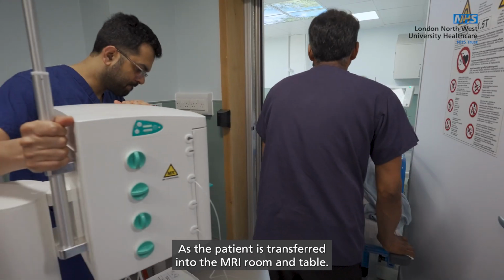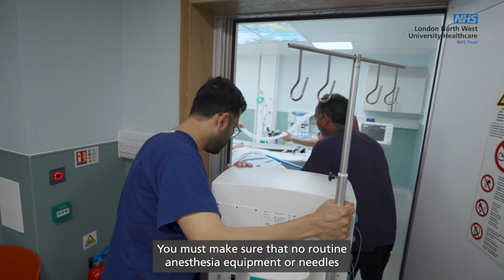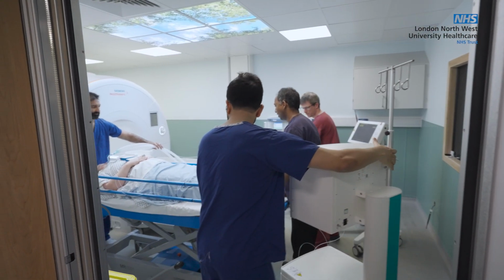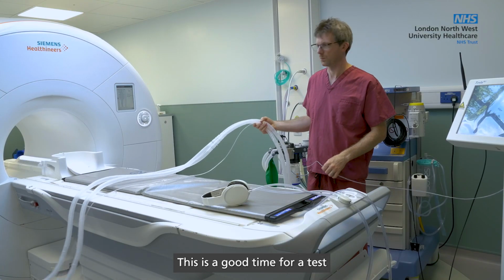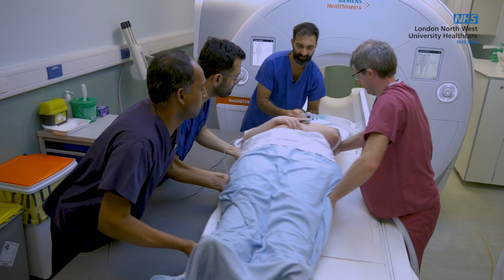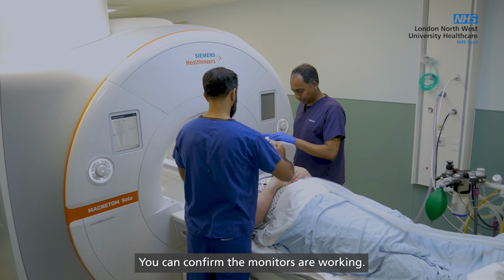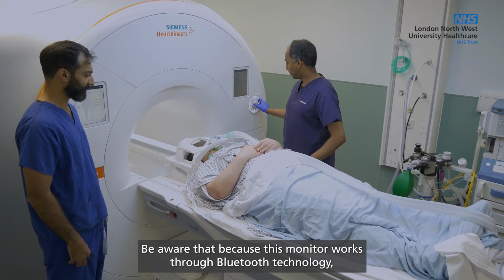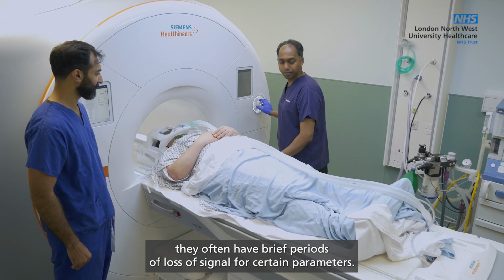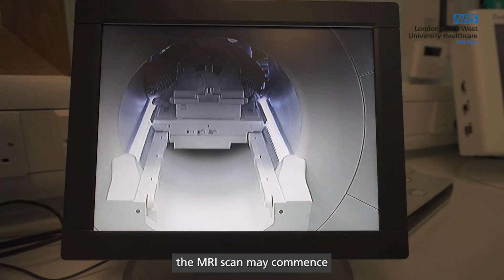As the patient is transferred into the MRI room and table, you must make sure that no routine anesthesia equipment or needles enter the MRI exam room without the approval of the MRI radiographer. This is a good time for a test run to ensure all cables and lines have enough slack. Inside the control room, you can confirm the monitors are working. Be aware that because this monitor works through Bluetooth technology, they often have brief periods of loss of signal for certain parameters. Once all the systems are validated, the MRI scan may commence.